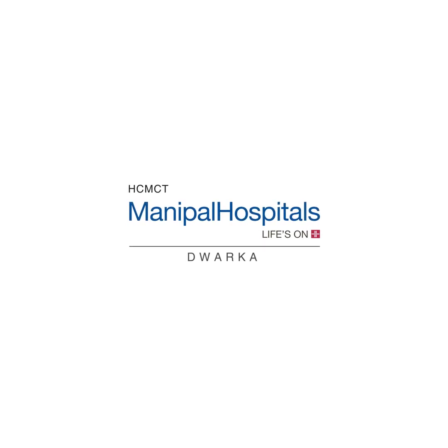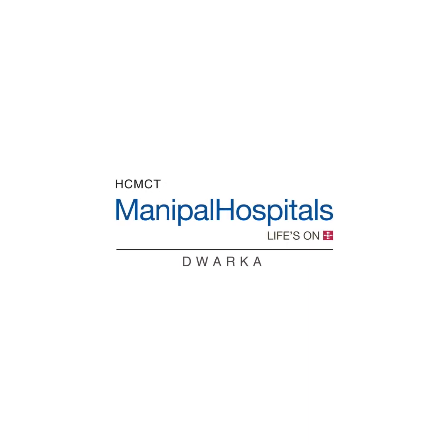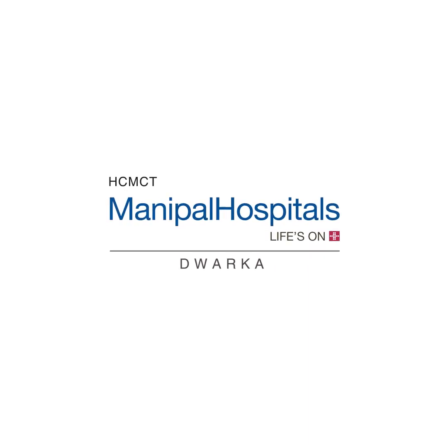Namaste. We at Manipal Hospital Dwarka are going to demonstrate to you the donning and doffing of personal protective equipment for working in a COVID-19 area.